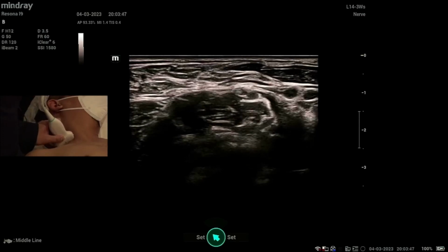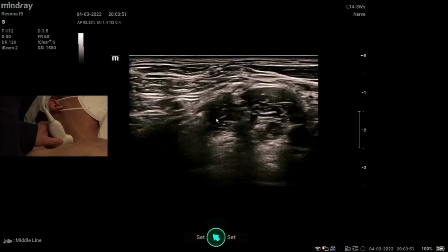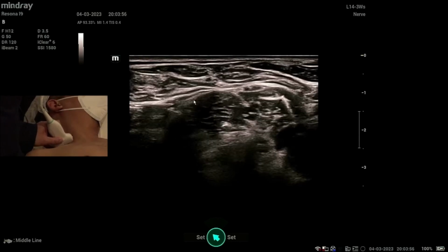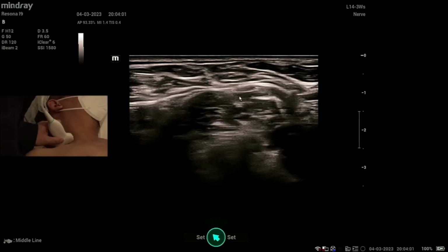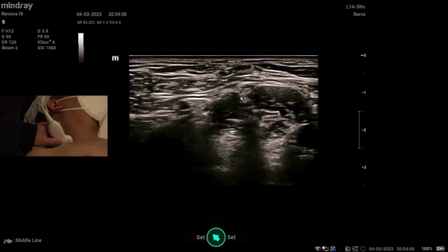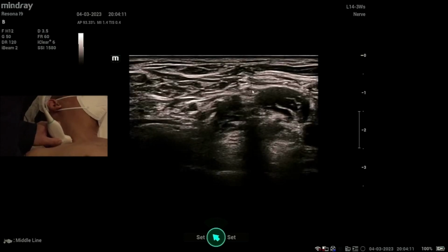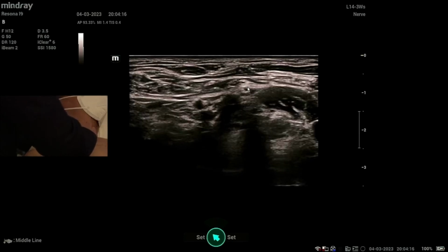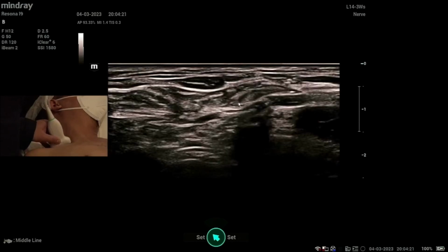And I think Dr. Kyril showed just now the superior trunk block. So let's just trace the superior trunk. On the right side is medial. Yeah, that's the superior trunk. And I think Dr. Shah was asking about the shoulder, the phrenic nerve sparing nerve block. So what we're going to look for is the suprascapular nerve coming off the superior trunk.